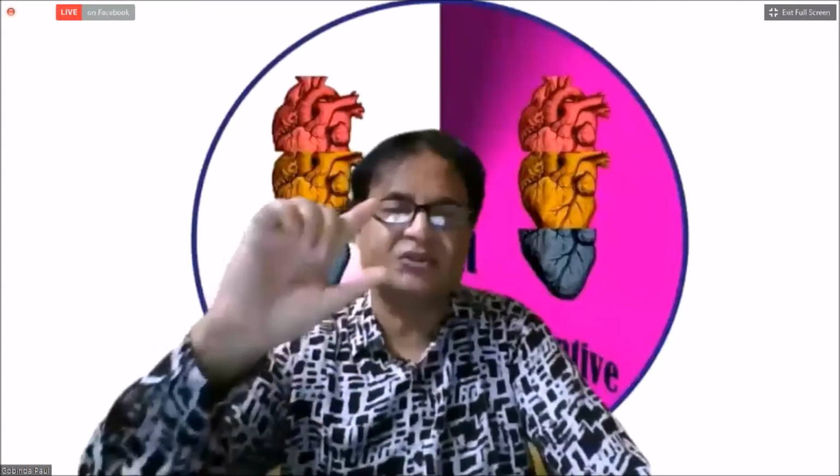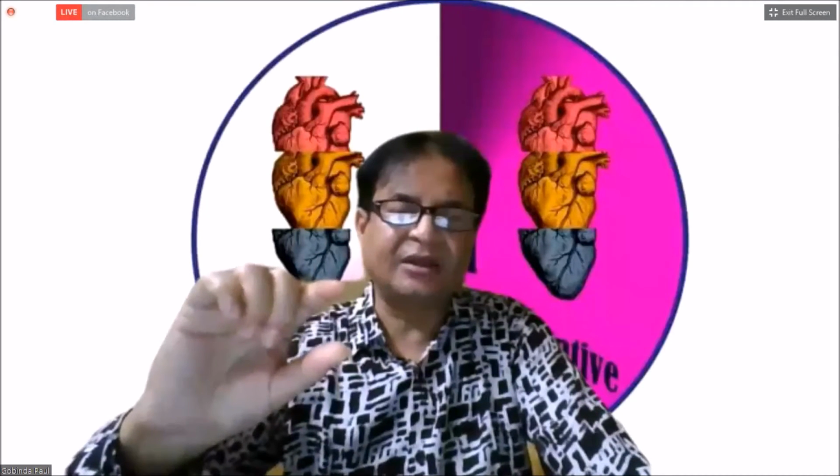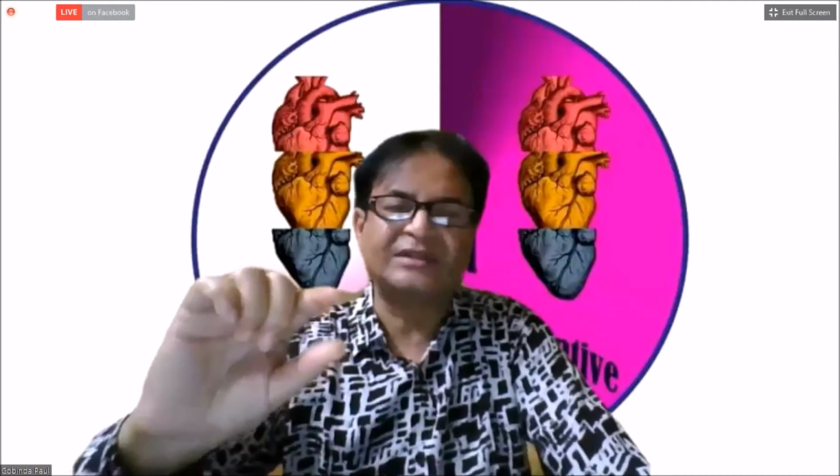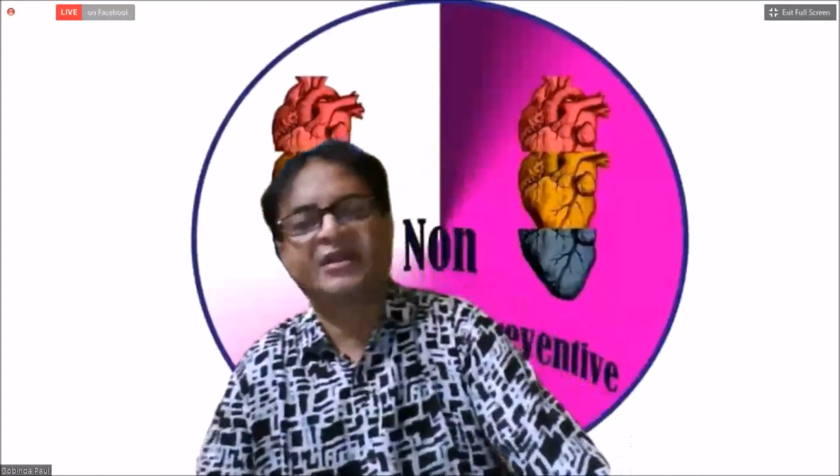There is a systolic excursion, in systole and diastole. This is the vertical height. It correlates, usually at bedside echo, with severe LV dysfunction. In case of severe LV dysfunction, usually MAPSE gets importance.